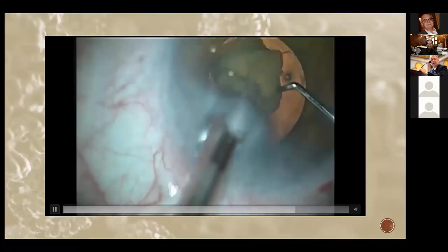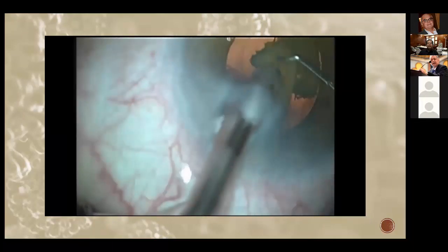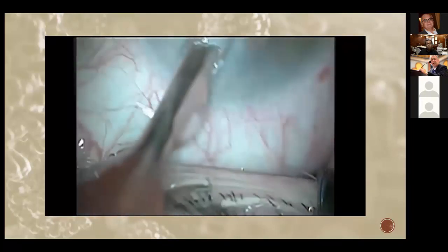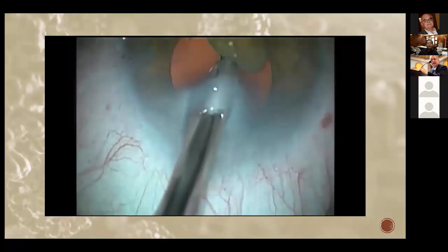That means that I'm going to get my capsule entangled in my phacotip. The patient is moving, so I take out my phacotip quickly, and my chopper. The main power to take out is the chopper. I can keep my phacotip, but the chopper has to go out quickly.